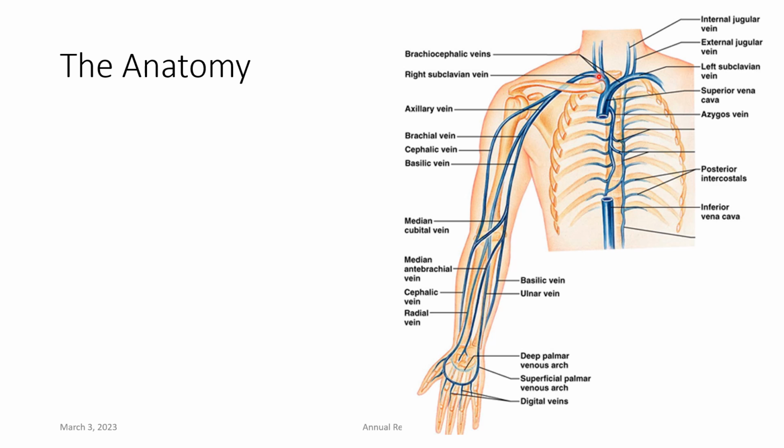Okay. Now our subclavian vein is going to come in, and it is going to connect with our jugular veins, and then it becomes the brachiocephalic vein, and it's actually that brachiocephalic vein that then dumps into the superior vena cava. So here we have a deep system, which is our radial and ulnar, coming together to create the brachial. We have our superficial system, which is really our basilic and our cephalic, coming in.